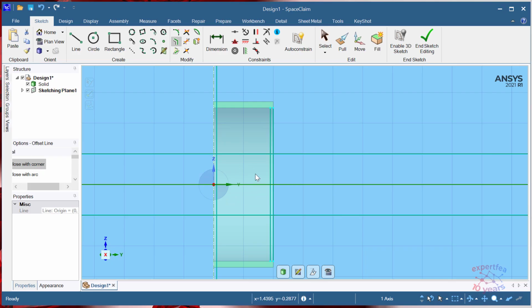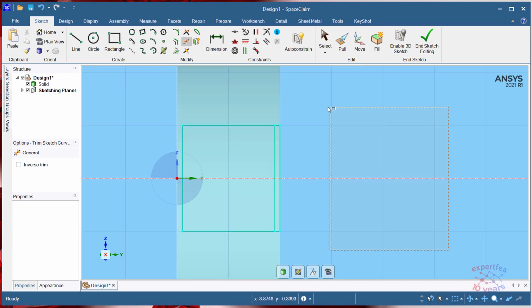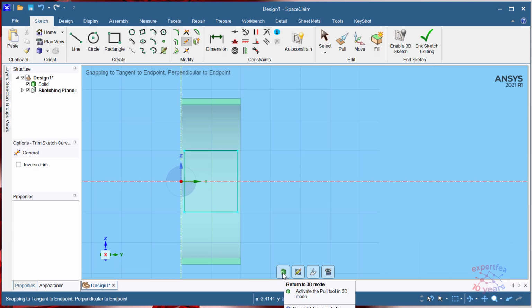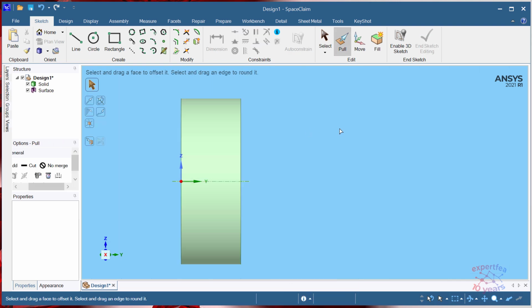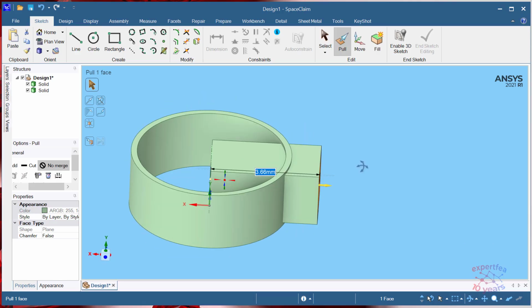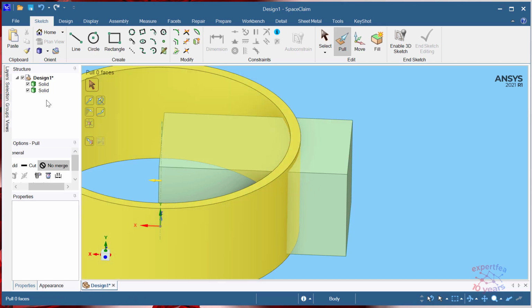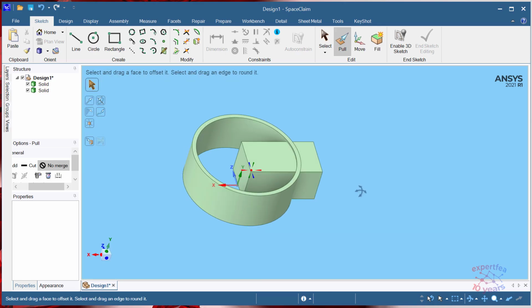Then useful for me is everything inside here. Then I can use a trim away operation, something like this. Yeah, this is the window that I need. Let's go to the 3D mode, and with this I will click no merge, I will just pull here and create a parallelepiped. I click no merge, so we don't have a single body, we have two separate bodies here.